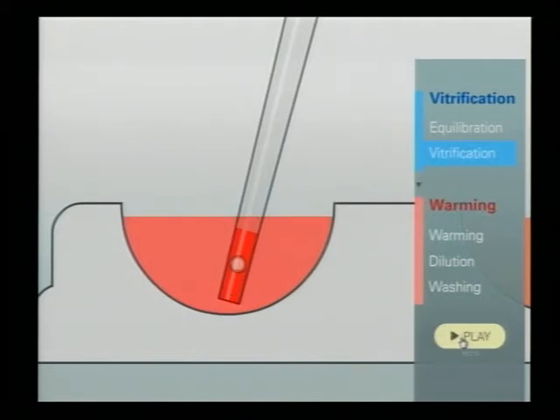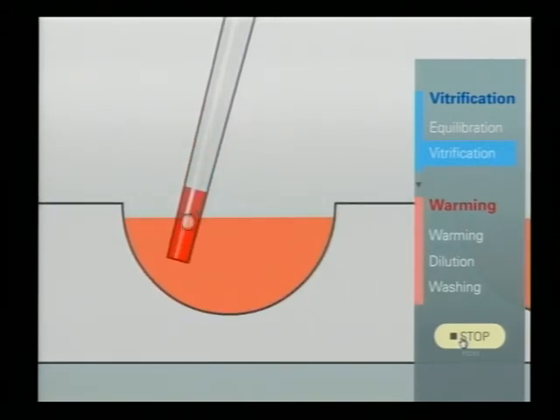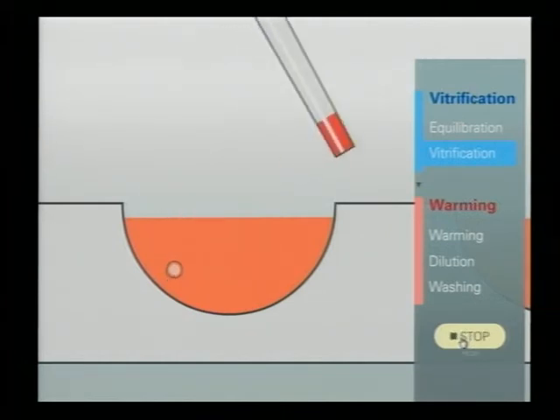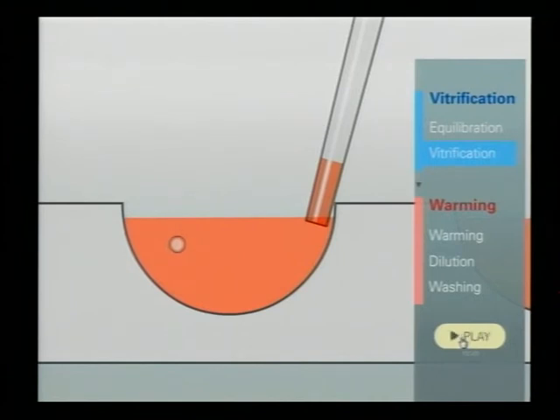Okay, take oocyte in the pipette, not top, just one or two spaces of oocyte. This is important. Then place the oocyte in the middle of depth of the solution. In my old cryotop system, we just threw it and mixed. However, if we mix them well here, the previous solution still remains in the same depth. So I give a modification - you give more weight to the solution. If you place the oocyte in deep depth, it immediately comes up, can raise, float to the surface while mixing and changing the extracellular solution.